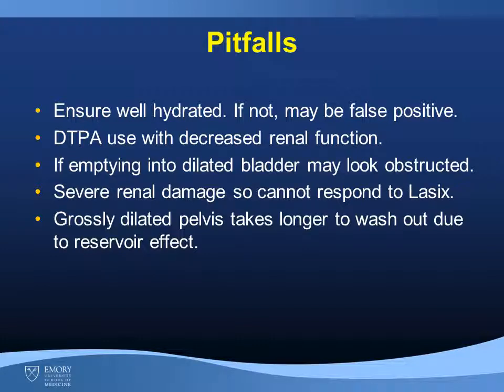Remember that DTPA may not have the sufficient extraction to really show renal function as well, so it can look decreased. If the patient is emptying into a dilated bladder, it may look obstructed. Remember to have the patient void beforehand. Severe renal damage can cause a situation in which the kidney cannot respond to Lasix, so those gravity views can be helpful. And also grossly dilated pelvis may just take longer to wash out due to reservoir effect. So in that case, the T1/2 may be expected to be 15 to 20 minutes, and that's as good as the patient's going to get.